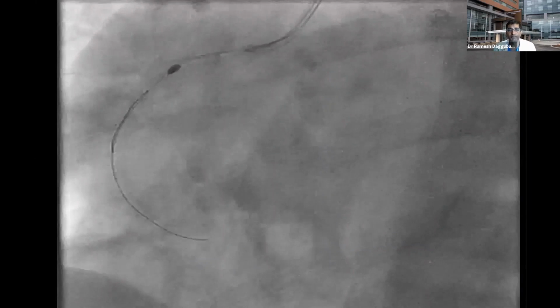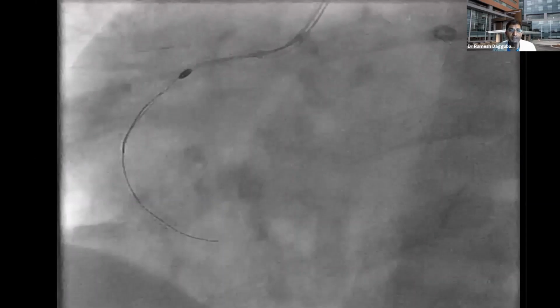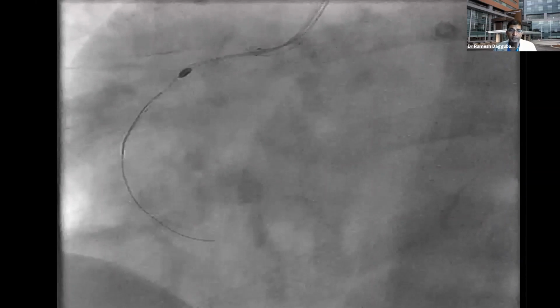It did not work. Some people said inject something else. I injected, I think, some mineral oil or something, through the guide catheter. It didn't loosen up. And whatever the Boston tells you, to go cut the back end and try to pull it, nothing worked.